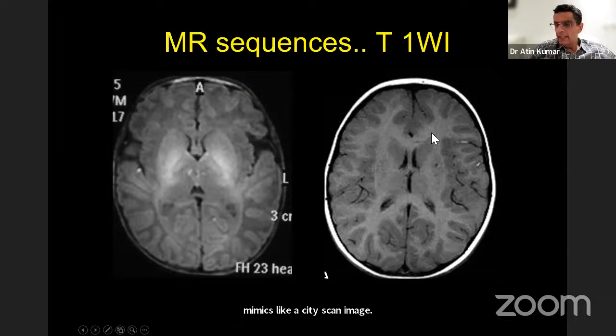This becomes slightly different in a myelinated white matter. So if you see, this is the myelinated white matter. When the white matter becomes bright, the fluid remains dark. But since you are all predominantly neonatologists, you will unlikely see a myelinated white matter. This does not happen till at least 5, 6 or 8 months of age. So let's slightly forget about it. Let's try and concentrate here.